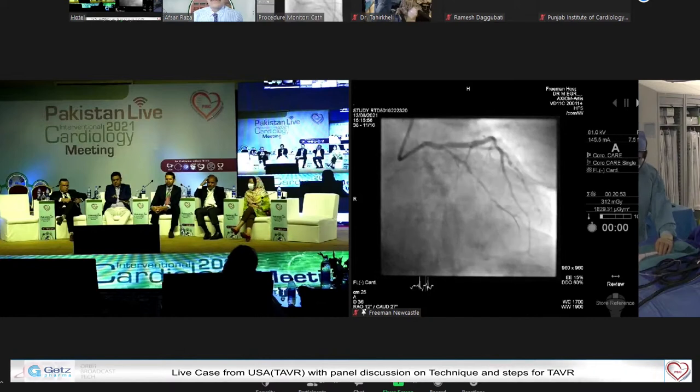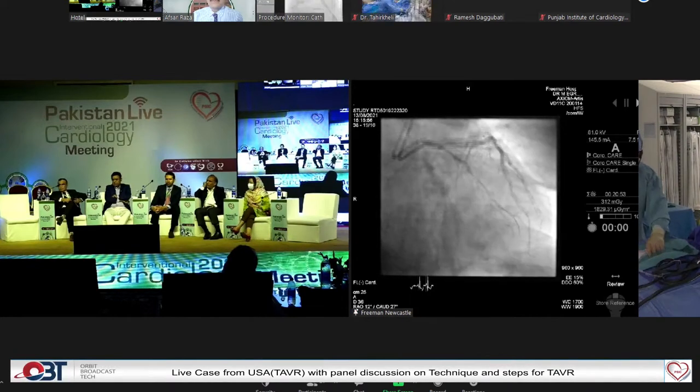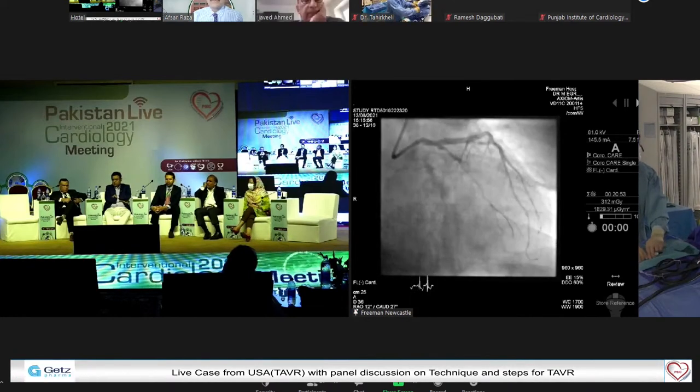What percentage of your cases do you use Impella in the left main? So, you know, Impella is not easy, and there was an initial enthusiasm.